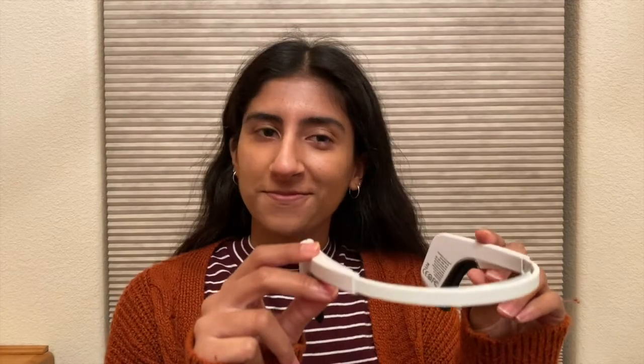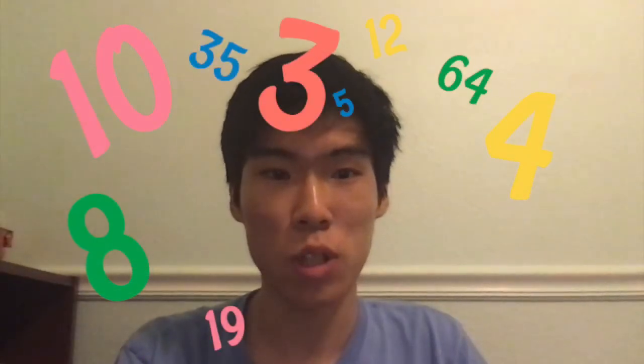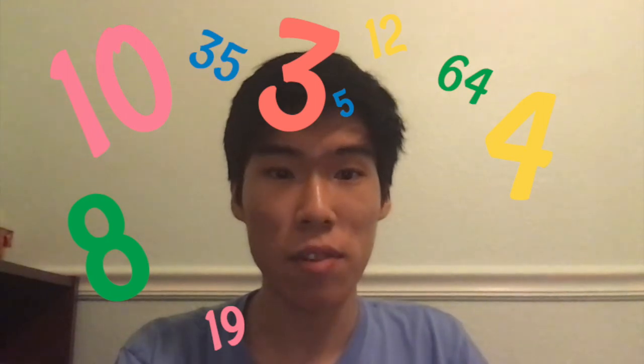During the first minute of the recording, the participant closed their eyes and relaxed, and we used this data as our baseline. During the second minute, the participant counted backwards from 2064 by sevens in their head. The participant did not speak out loud in order to prevent unnecessary jaw movement that would affect the EEG data.